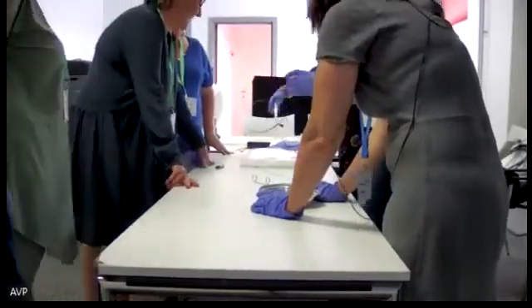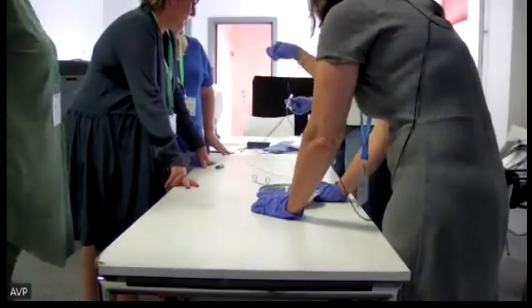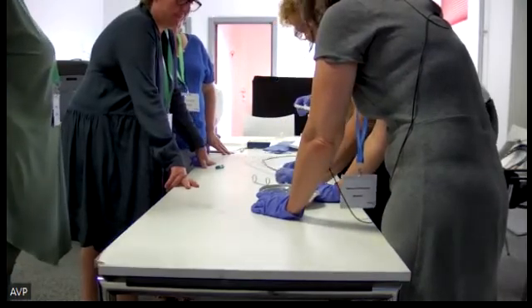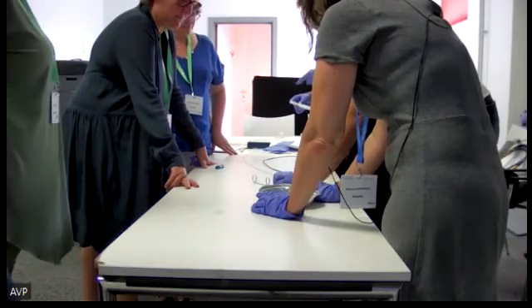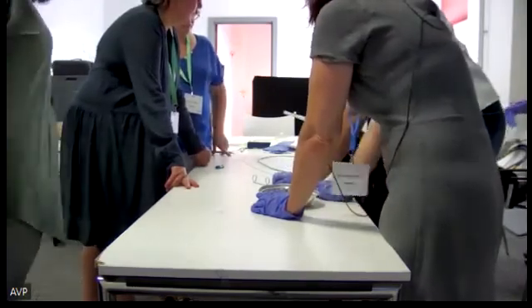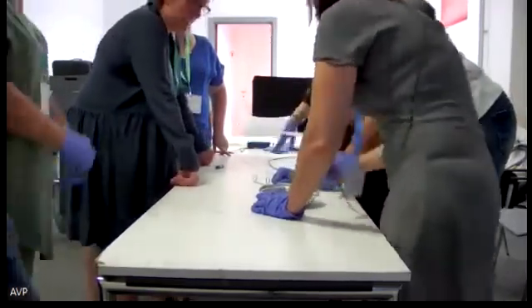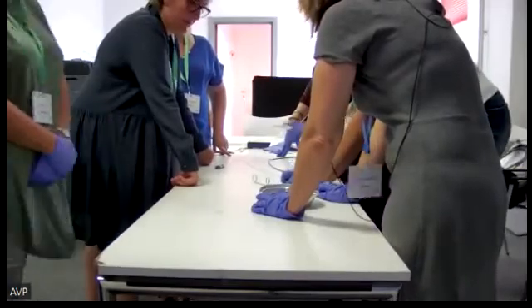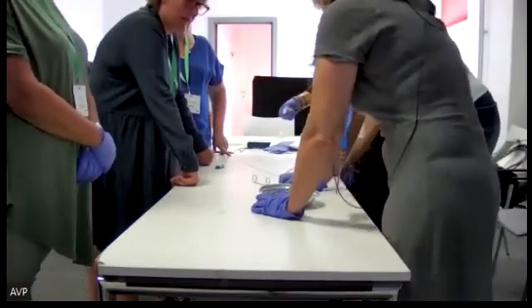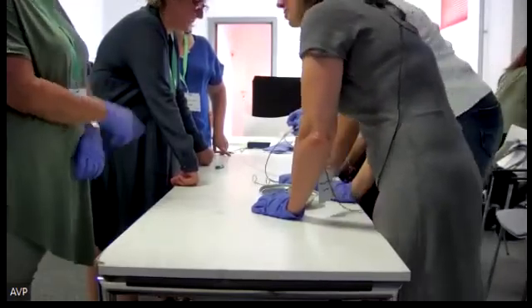So explain it in English. Okay, so passing through this, the cyst. We see it on the echo, to the scope, just in front of the cyst. We put the current on the good port, not this one, because the endoscope is kaput. This is in the scope. If you put the needle current here, white, no, that's puff. So we put the current there. I apply the current and push. First I put the current on the needle, then I push the blue or the yellow? The yellow.